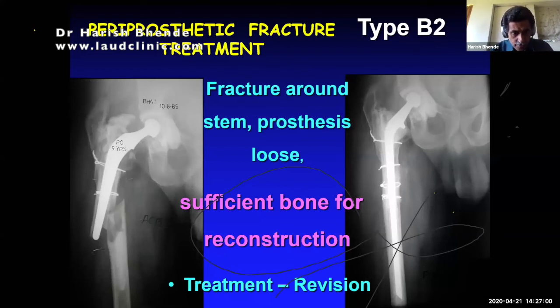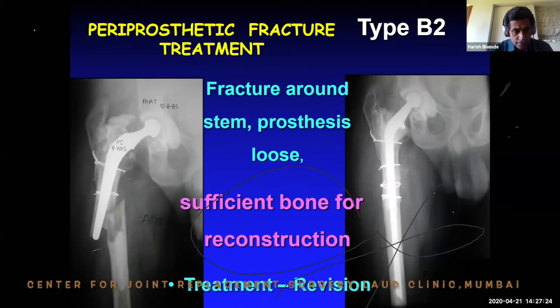This patient had a significant amount of cement mantle distally, almost about 2 inches going beyond the tip of the primary implant. So this required removal by doing an osteotomy, and then a long stem cemented implant was used. The patient was very elderly, and this has worked very well for the patient. If they are a young patient, then maybe you can use a long stem non-cemented implant, and we can see them later in a subsequent presentation. And these usually give a very good biological fixation along the entire shaft.